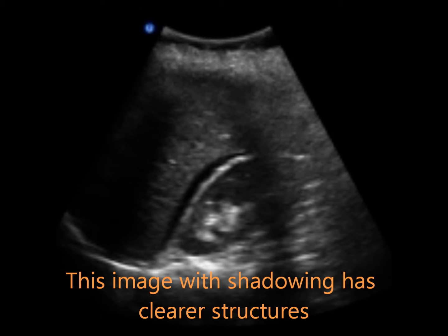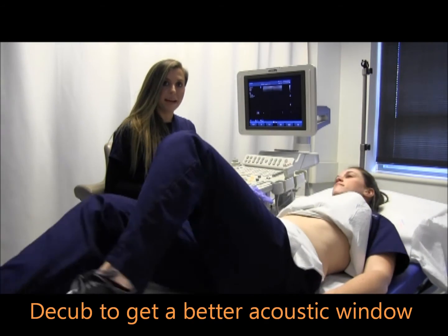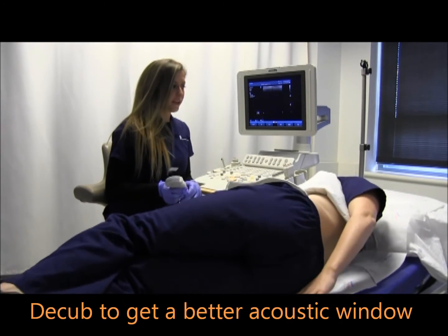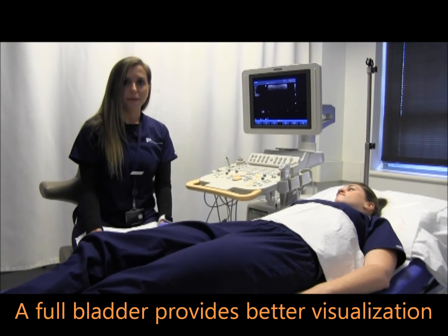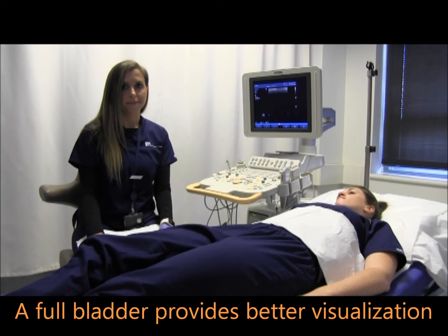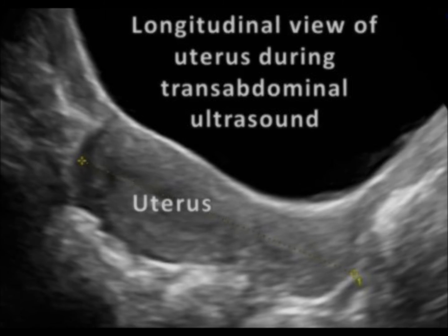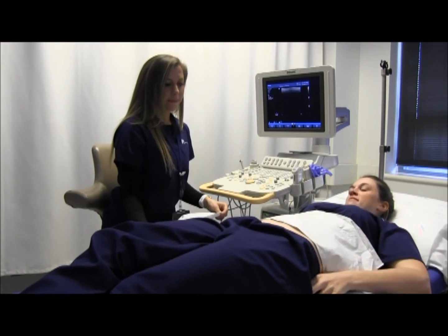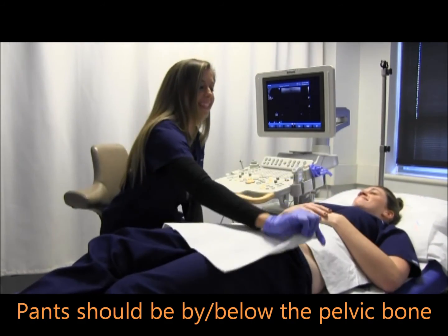Ask the patient to relax. To get a better acoustic window, you can ask your patient to turn to their right or left and put their arm over their head. For an accurate transabdominal pelvic study, the patient should have a full bladder. Ask your patient to lower their pants slightly, down by the pelvic bones.